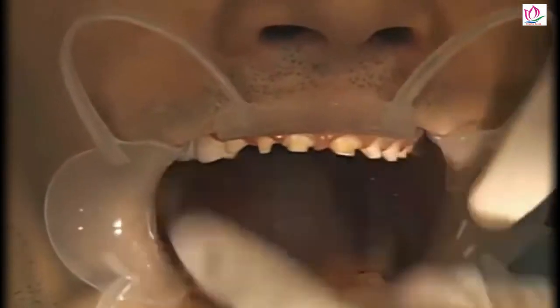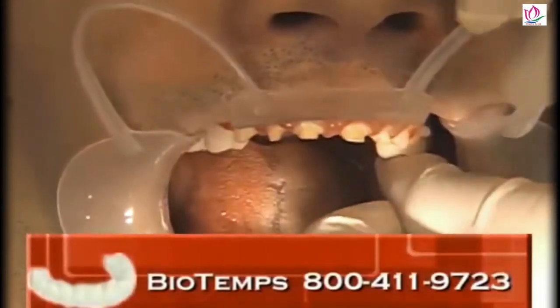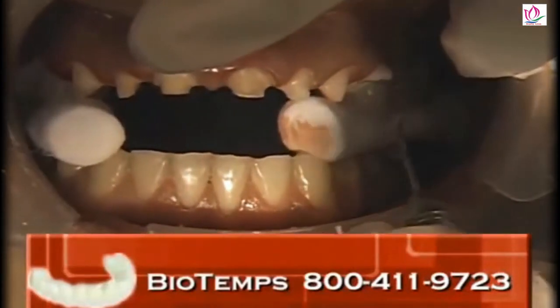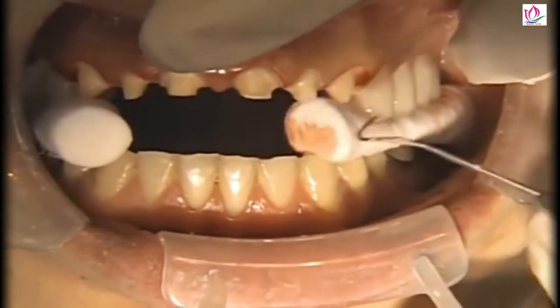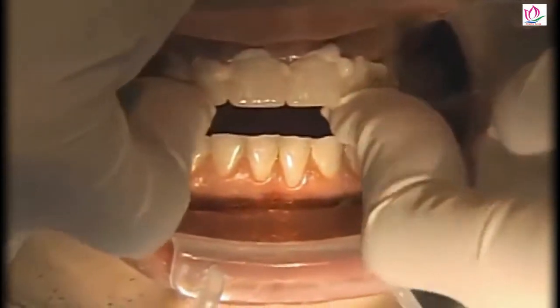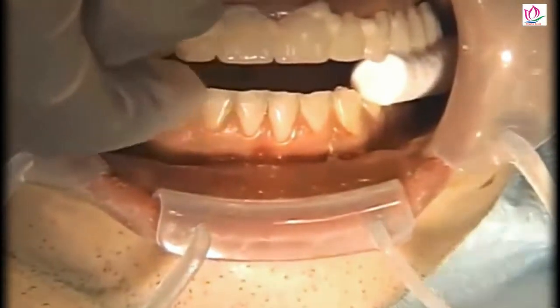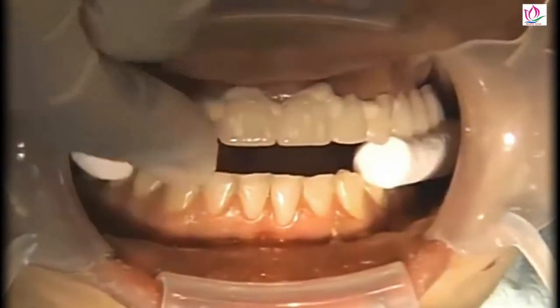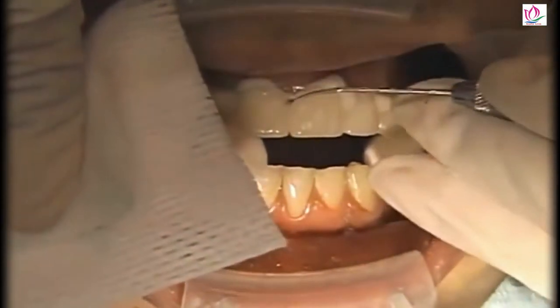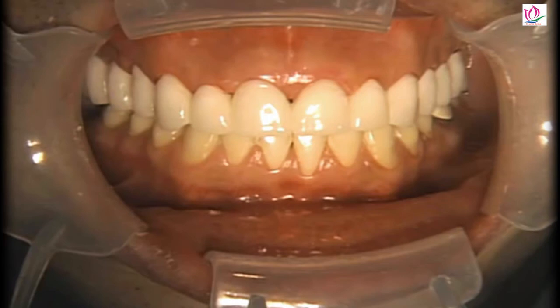We've now prepared all the teeth on the maxillary arch except for the second molars, and we're trying in the posterior segments of the biotemps. Since they fit, we're going to go ahead and reline those with the acrylic. The patient is biting down on a couple of cotton rolls, and while that is setting we're going to go ahead and place the anterior units as well. I'm pushing these into place with my fingers, and as that material starts to thicken we'll be able to remove some of the excess from around the margins and pump these units up and down on the teeth to avoid any undercuts.